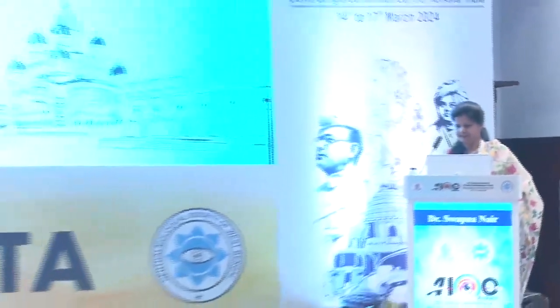The very nice videos. I just had a couple of queries. One was regarding the vertical vault, Swapna. So in spherical ICLs, it may be a good idea to try and see if you can put it oblique or vertical before exchanging it.